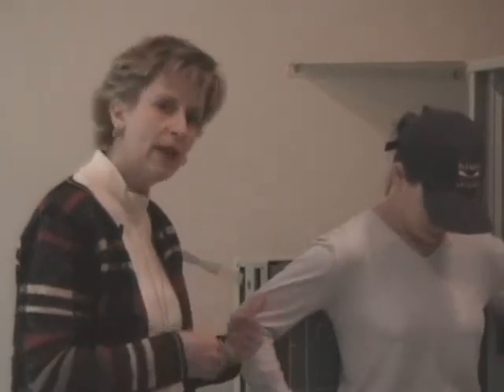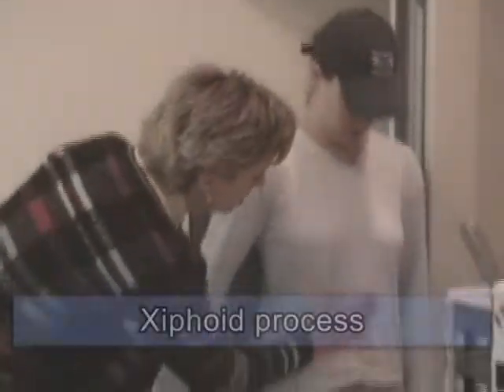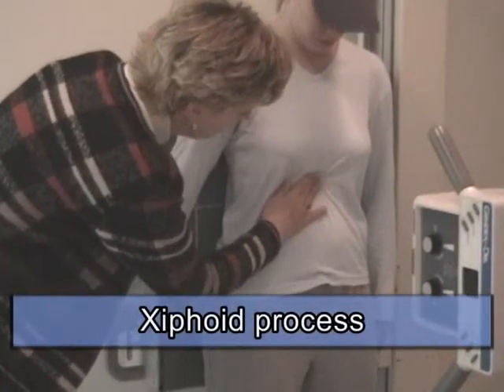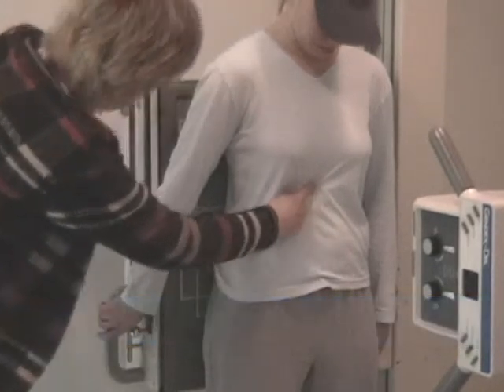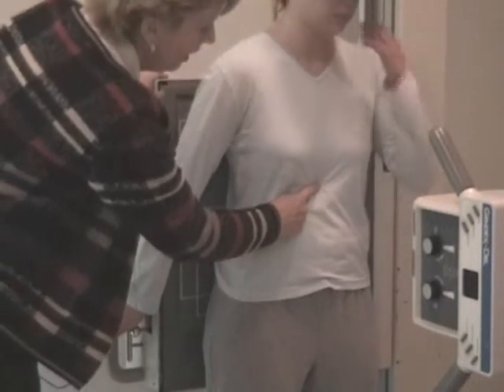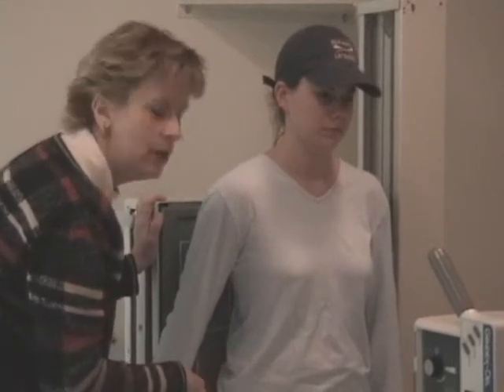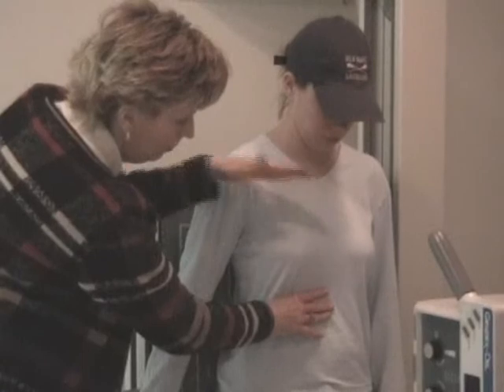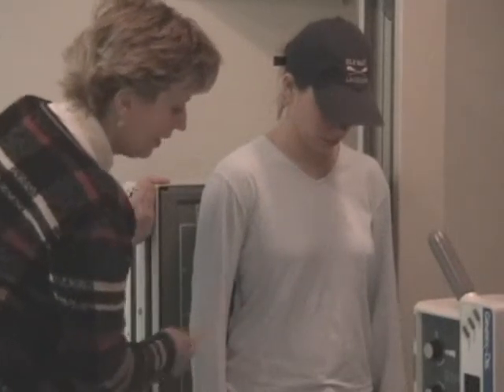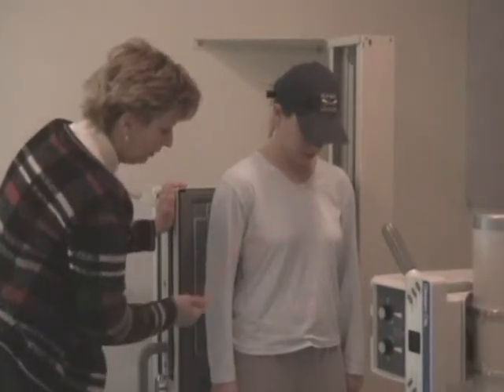To help you know when to make that decision to raise your film or not, I'm going to show you some tricks. You can use the xiphoid process, which is approximately at the level of T9, and if your film's edge is well above T9, you know that you're going to have diaphragms on there, because when the patient takes in a deep breath, the diaphragm lowers and is visible beneath the 10th posterior rib. So I've got plenty of film clearance here, and I'm not concerned at all about raising the film. I want as much of the abdomen on there as I can get without clipping diaphragm.